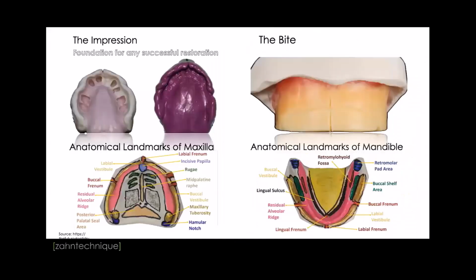So our first slide will remind everybody of our first two modules that we did one week ago and two weeks ago: the importance of the impression, which is obviously the foundation for any successful restoration.